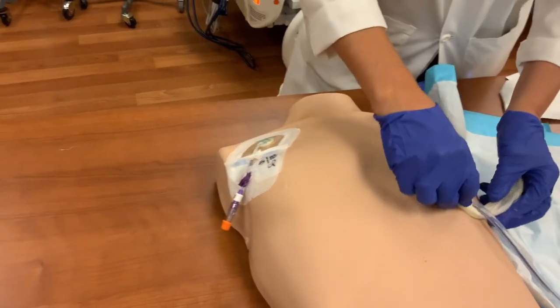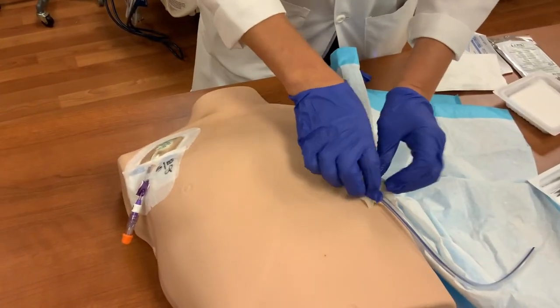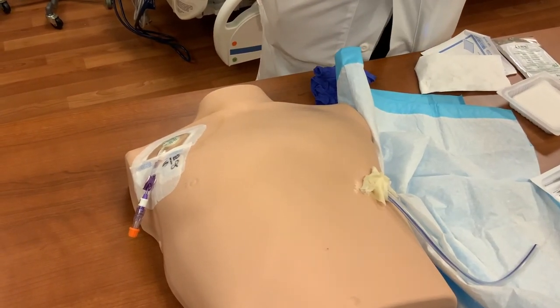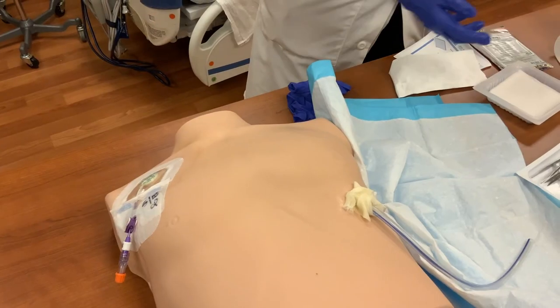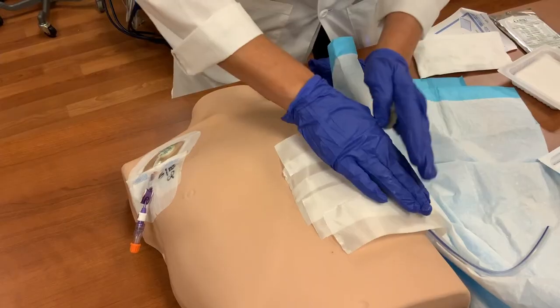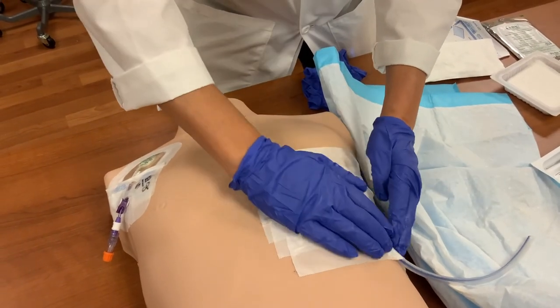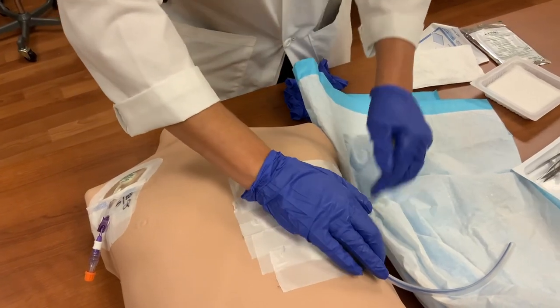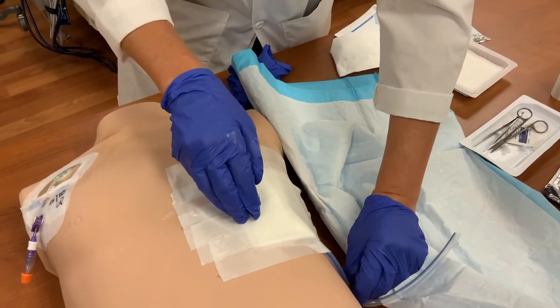Take the petroleum gauze and wrap it around the chest tube at the entrance site. A Blake tube is a smaller gauge chest tube, so only half of a petroleum dressing is used. For the standard, larger chest tubes, use an entire petroleum dressing. The petroleum dressing helps to seal the entrance site so as not to allow any air back into the chest. Then take the 4x4 adhesive dressing you prepared and place the 4x4s directly over the petroleum gauze. Press firmly around the entire dressing ensuring that it has adhered well to the patient's skin on all sides. You can add additional tape to the dressing to ensure proper adhesion.